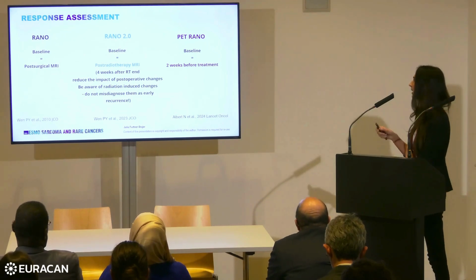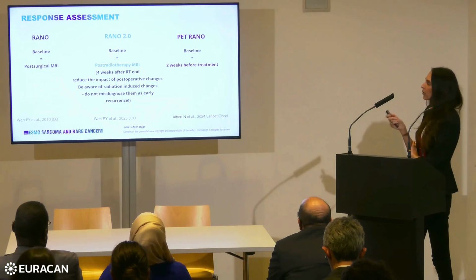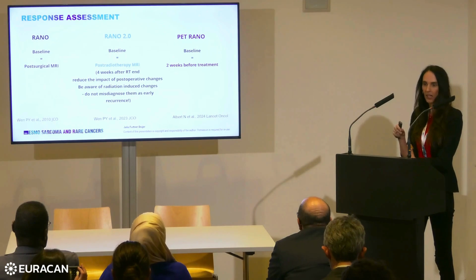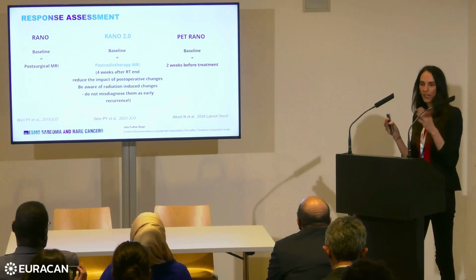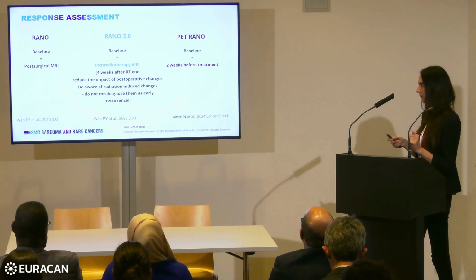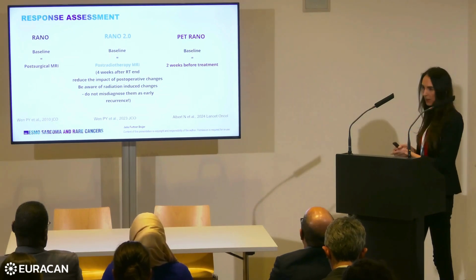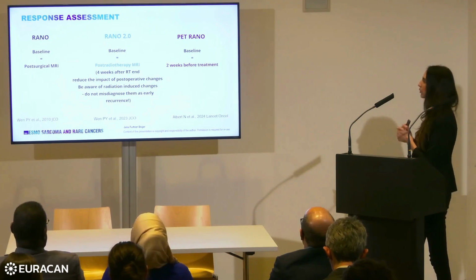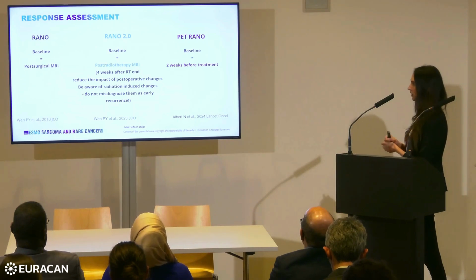I think one of the most important things in the new RANO criteria is the baseline MRI. And why is this? We were used to use the post-surgical MRI as baseline, which was 48 to 72 hours after tumor resection. Now we are recommended to use the post-radiotherapy MRI 4 weeks after the end of radiotherapy to reduce the impact of postoperative changes.